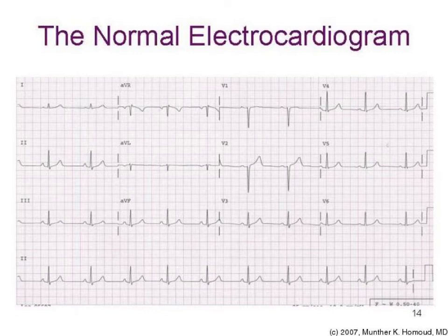So when we put it together, this is what a normal ECG would look like. A patient who has an ECG tracing from the 12 different leads that we mentioned earlier shows you 3 different beats represented here, 1, 2, 3, and depending on which lead you're looking at, the electrical activity appears in a different form.